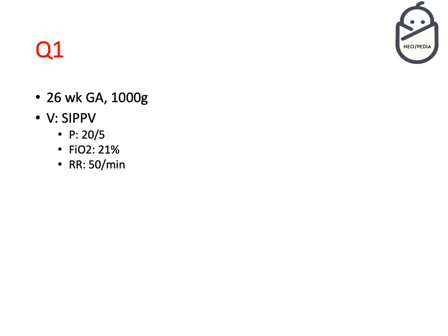So quiz time. You have a 26 weeks old, and his weight is 1 kilogram exactly, and you can see the ventilator settings here. The pressures, PEEP of 20/5, and in air, and the respiratory rate is 50, or ventilator rate basically, and your minute ventilation is 0.2 liter per minute. But your saturations are 85% only. And this is your gas down there. So what do you think is the problem then?